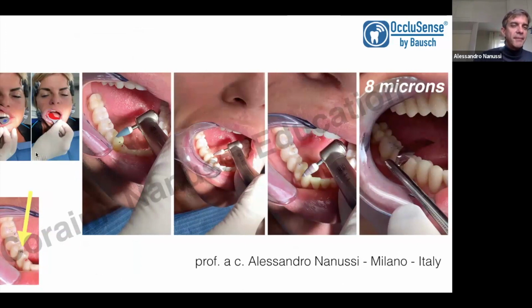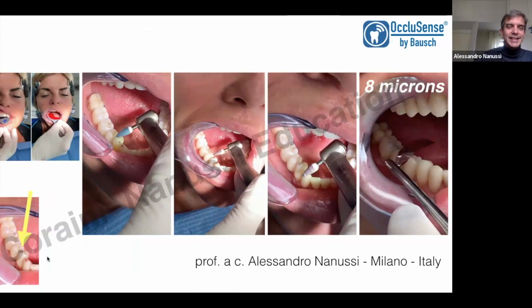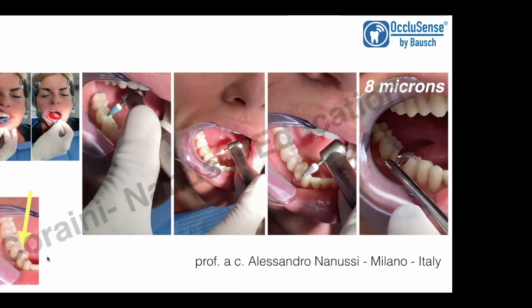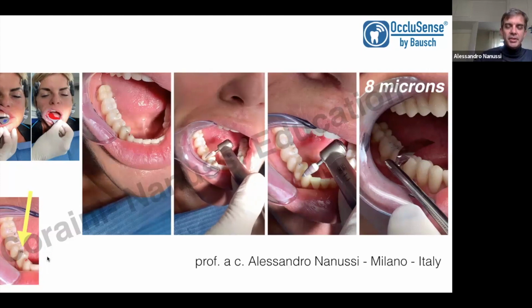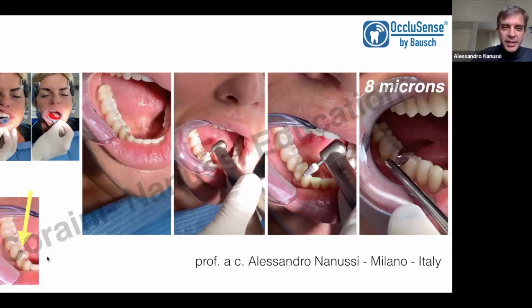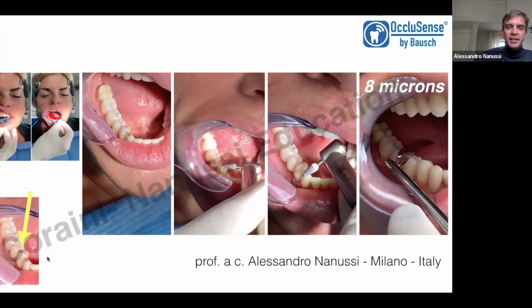You can see here, for example, with our fantastic paper of 12 microns of thickness, a precocity in this area, just a little precocity. But this is only a static analysis, in black. With the rubber cutter, we can correct it, and it's important also to polish it and finish it perfectly to avoid cracks on the tooth.